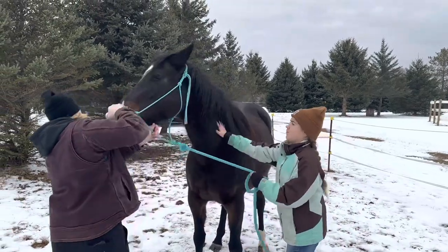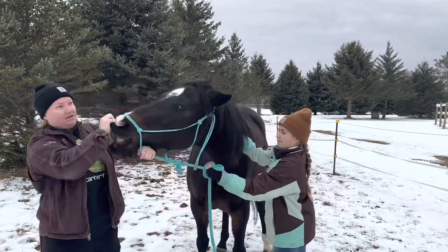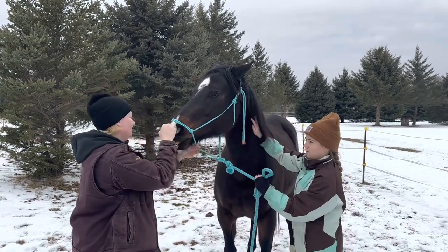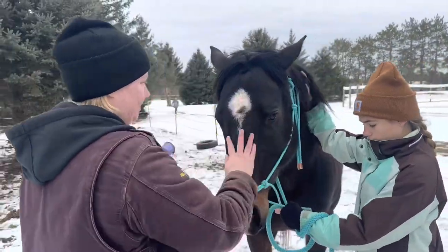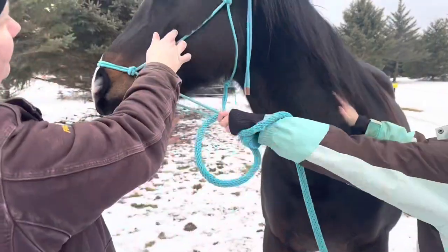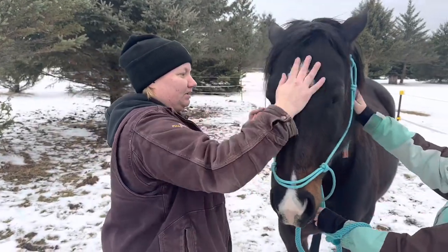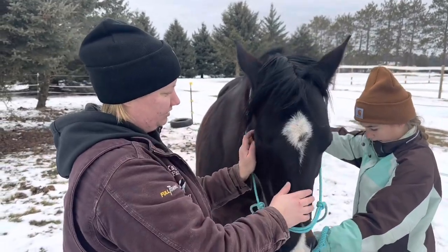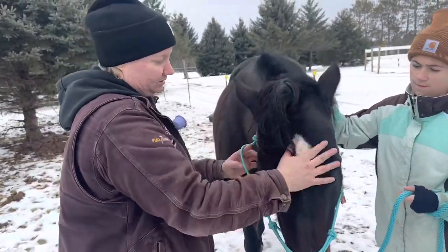Easy. Some horses just don't like it. So we can just kind of wait her out there. Good girl. All right, so we're trying to figure out River here, and she seems a little sore. What you can do is run your hand down the side of her teeth, and you see she wants to yank away when we get to a certain point. Easy, pretty girl. She also will do it on that side. So she probably has some sores way back here. She's got a really narrow mouth conformation. So she's definitely a horse that needs to be kept up on every six months, so twice a year.